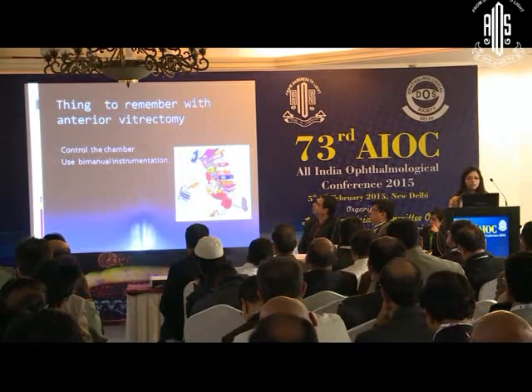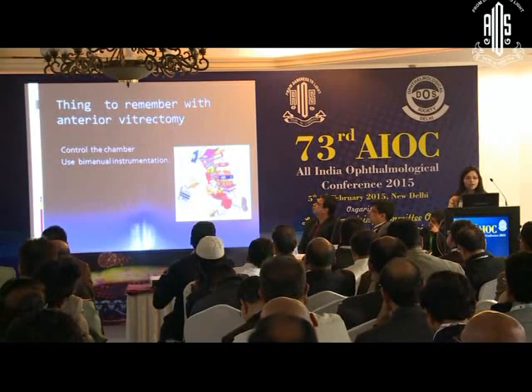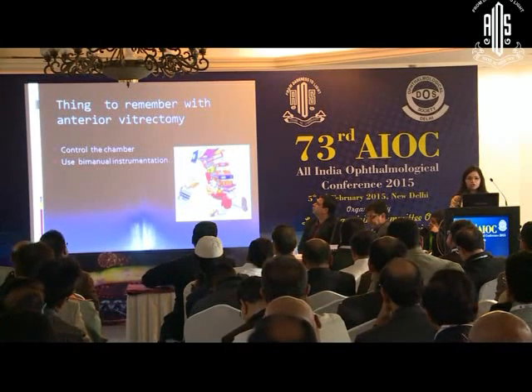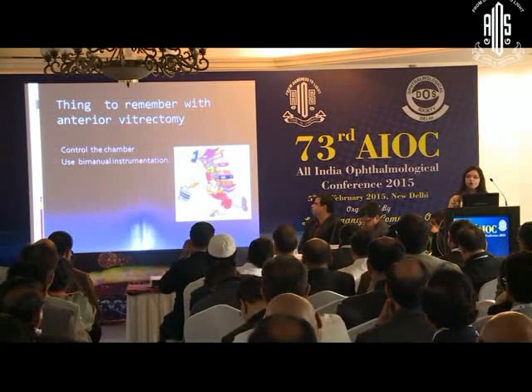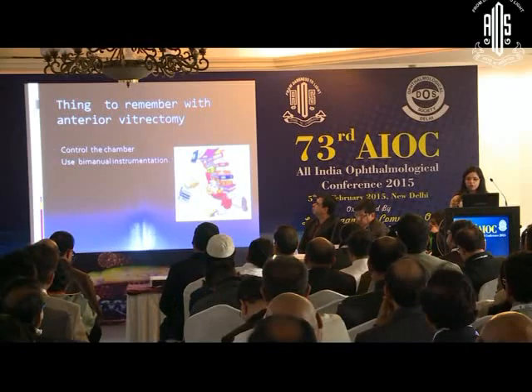So in the end, just a take-home message for anterior vitrectomy: one must always close the chamber. You should do a controlled chamber anterior vitrectomy and always do bimanual instrumentation for anterior vitrectomy.